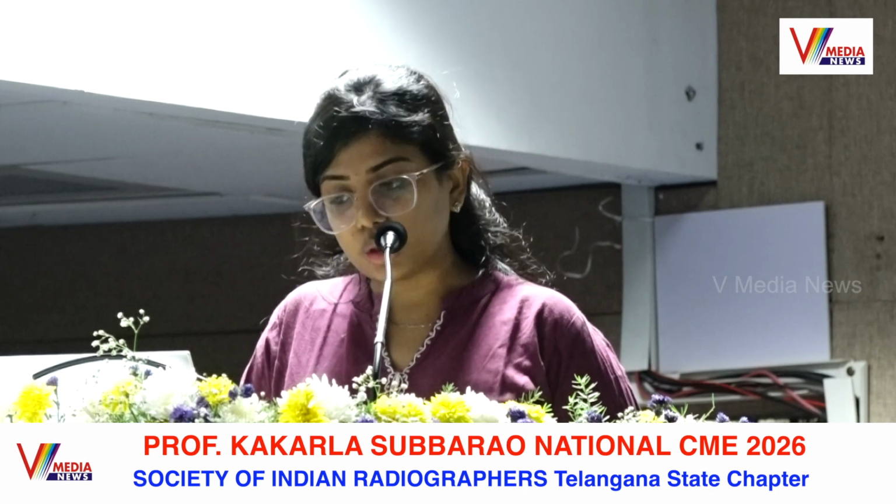This is the overview which I showed in the first slide. First is patient preparation. Heart rate should be less than 60 beats per minute. Beta blocker if greater than 60. Sublingual nitrate if not contraindicated. IV line preferably 18 to 20 gauge. Breath hold training is required.